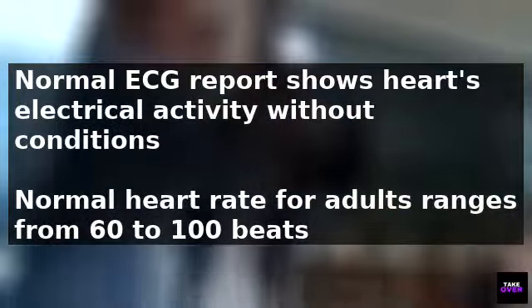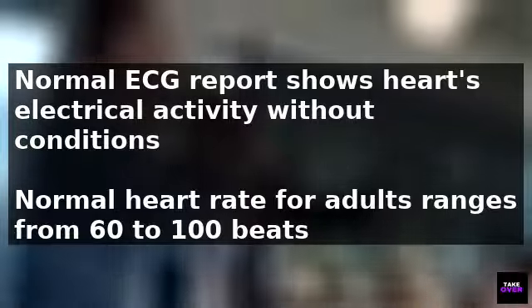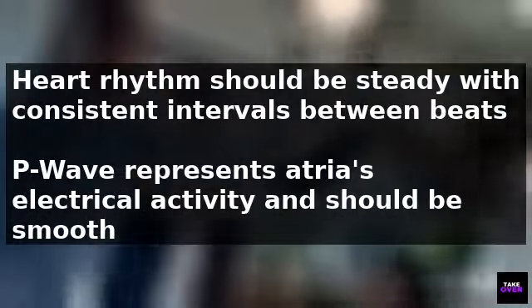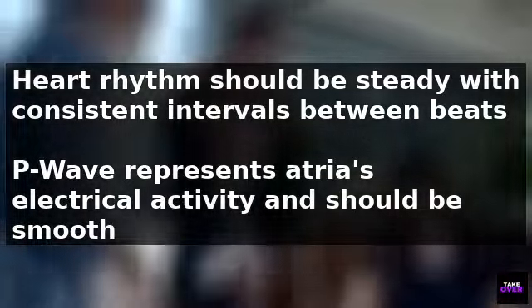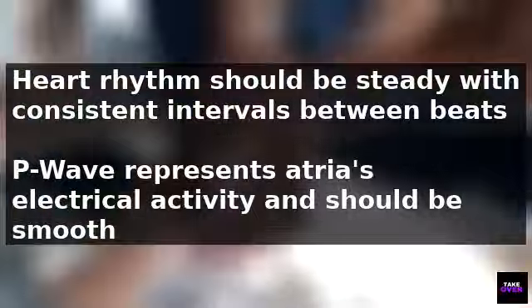A normal heart rate for an adult ranges from 60 to 100 beats per minute. Next, examine the heart's rhythm, which should be steady with consistent intervals between each beat.